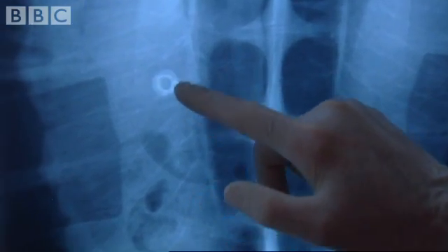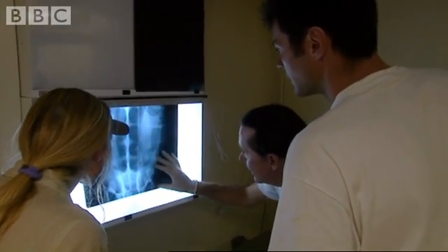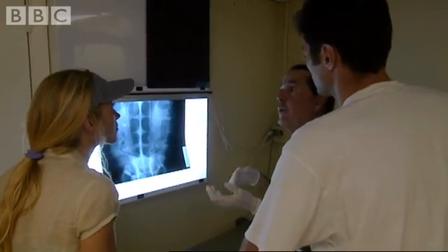These are barnacles, and they're very distinct. I don't see any tumours in here, which looks good. Nice and clear. It's a little white in here that I don't like. Let me show you one from what they look like when they're really bad.